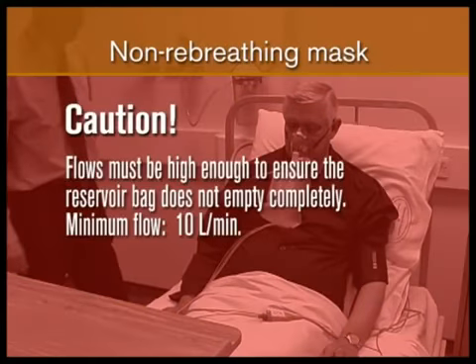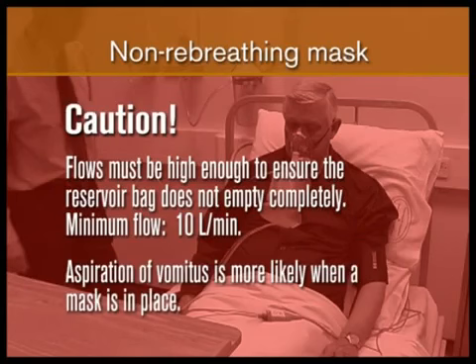Caution: flows must always be high enough to ensure that the reservoir bag does not empty completely at the end of inspiration. Minimum flow 10 litres per minute. Aspiration of vomitus is more likely when a mask is in place.